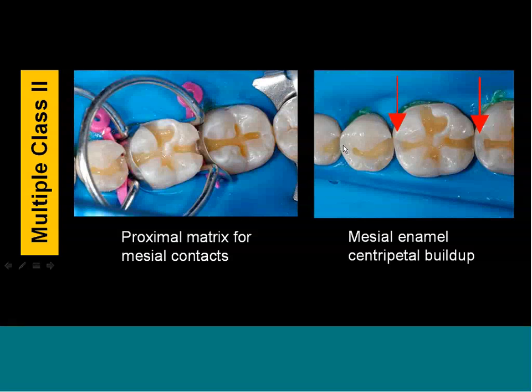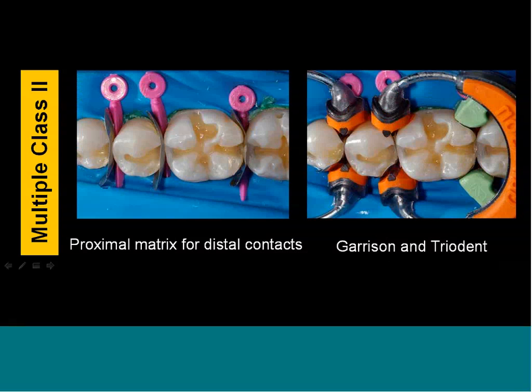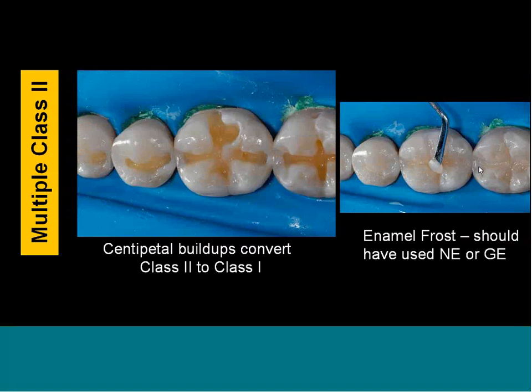So here, now we're moving towards doing the class ones like we talked about. And then here we've got distal, distal, distal, and I popped on. So here you have kind of like the combo platter. Here you have some Garrisons, you have some Tri-clips, you can interchange them, and we're going to make sure that we get proper contacts here and a little bit of separation between the teeth. And then when the centripetal buildups are done, now we have a class one. Same, same, same. So now we can finish these up.